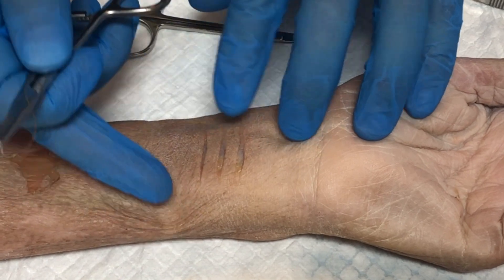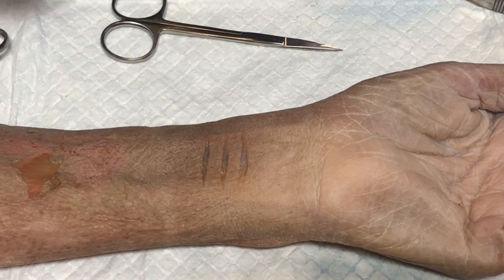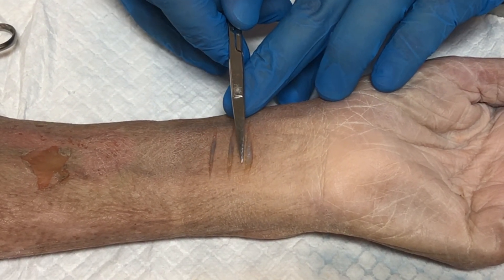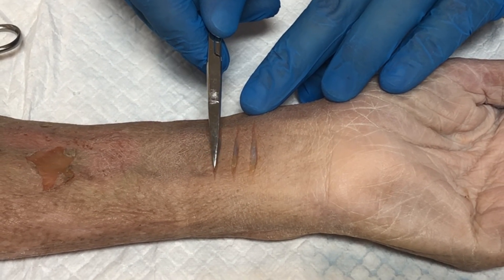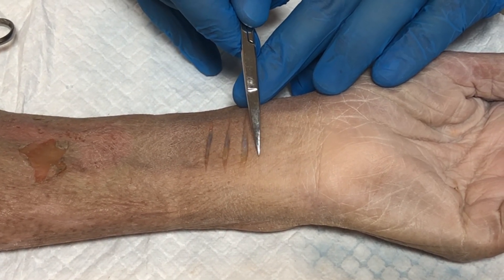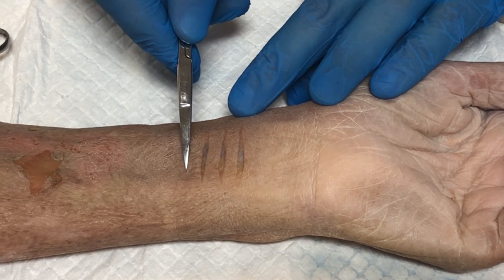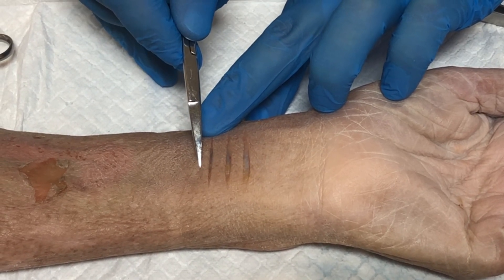We want to bring the tissue together effectively without compromising the blood supply. What I want you to think about is this is going to be a modified mattress suture. We're going to start here and essentially thread the suture material through these little tissue islands, exit down here, come across, and then go back through and tie our knot back here. It's a horizontal mattress suture.